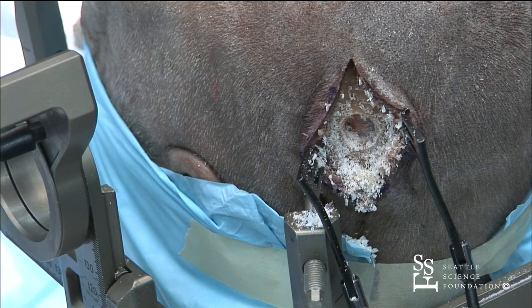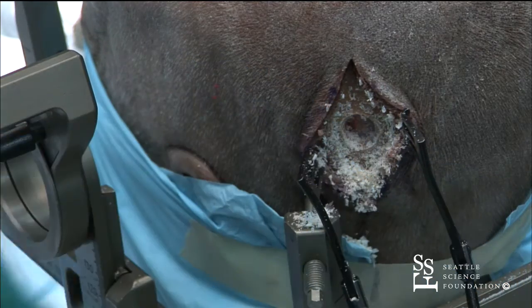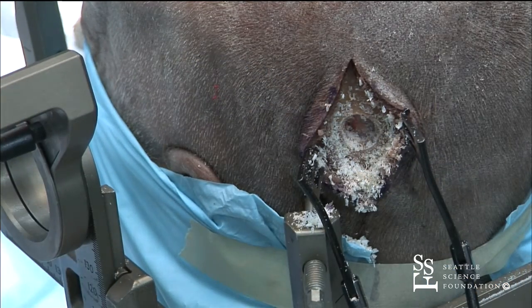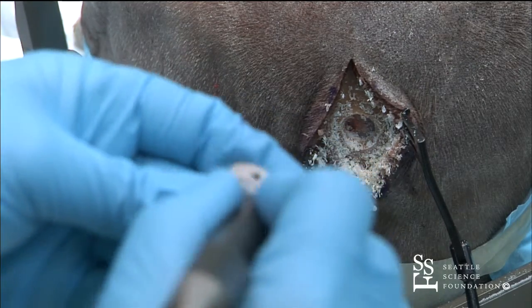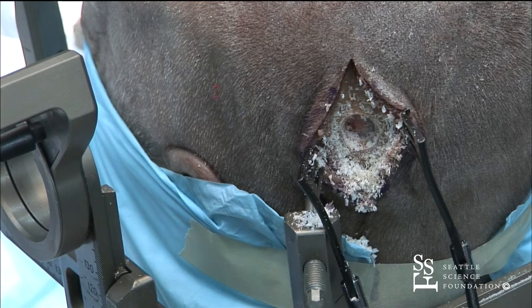So the NeuroPace burr hole cover is designed a little bit differently than the Medtronic. There's only one locking mechanism, which is this membrane, the clear membrane that's put in at the end.